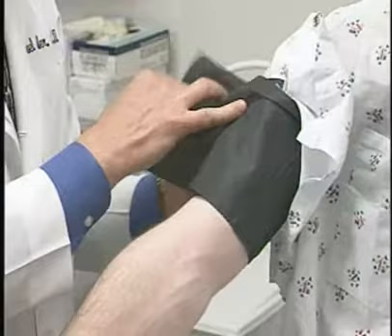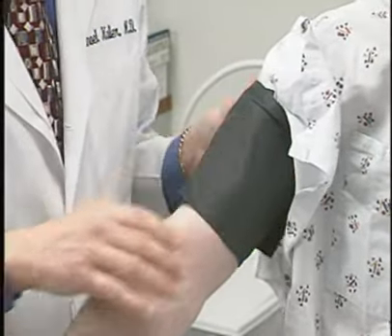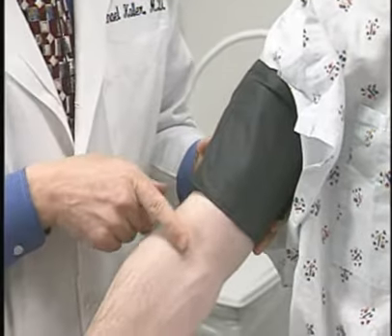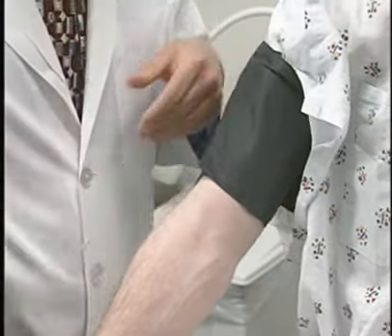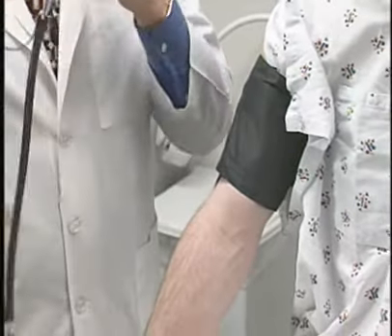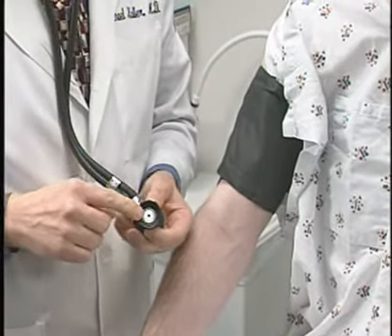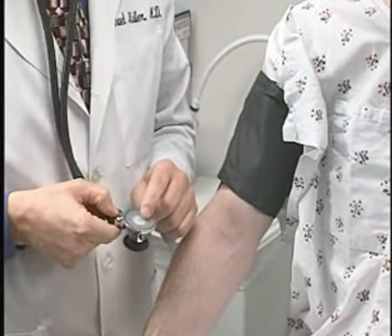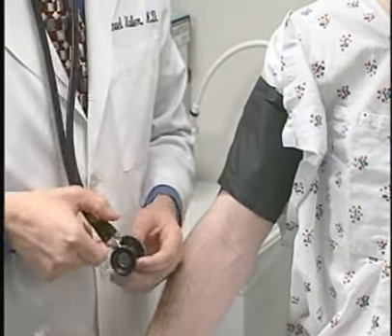You go ahead and place the blood pressure cuff snugly on his arm. You'll notice I'm approximately 2.5 centimeters above the antecubital fossa. Bates will recommend that you check the blood pressure with the bell of your stethoscope, but I think you'll find most physicians at Loyola use a diaphragm to measure blood pressure.